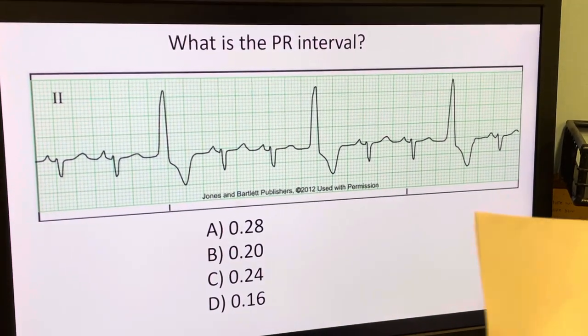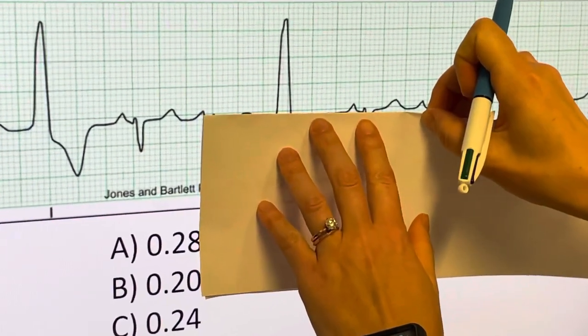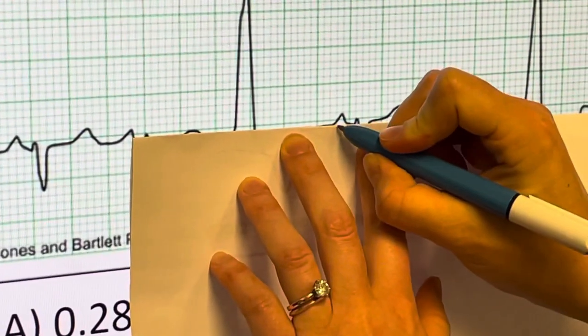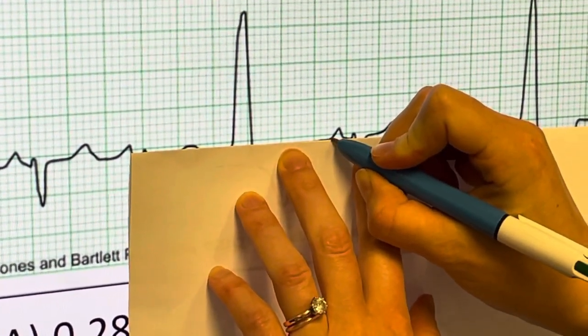So again, I'll just take my paper, find a P wave, and draw a line where it starts to leave the baseline. That's the beginning of my PR interval.